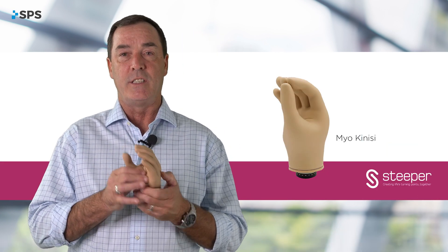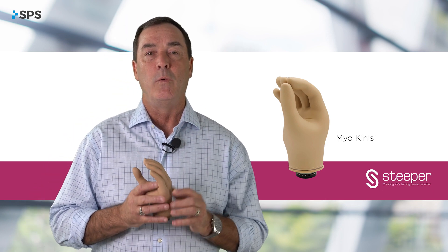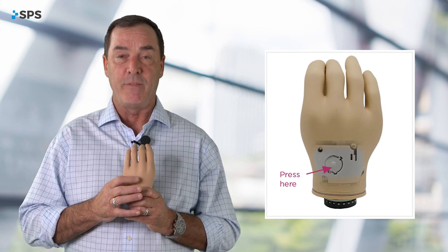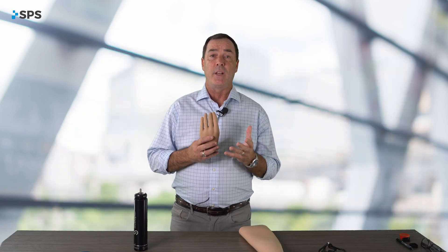It's the Kinesi hand. The Kinesi hand is a standard system type three-jaw chuck hand with some really cool features and benefits for the patient. One of which is a function switch. The function switch allows you to power the hand on, power the hand off. It also allows the user to engage the auto-grip feature.